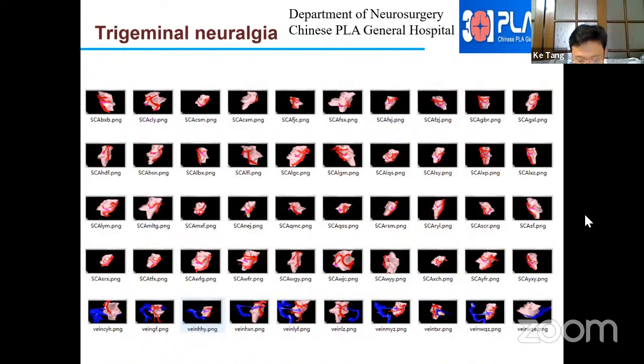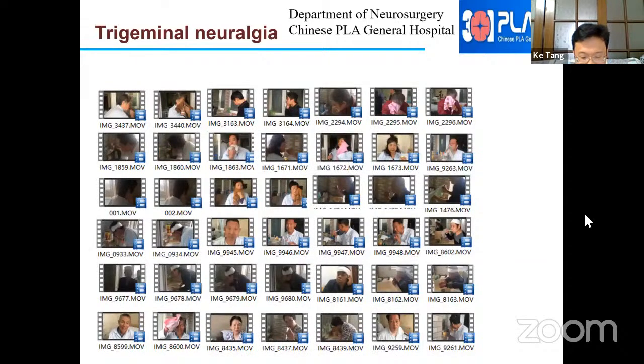With the application of this technique, there was no need to perform additional intraoperative MRI, and the duration of stereotactic head frame immobilization is shortened. In addition, clear display details of the neurovascular complex on high-field strength MRI will help determine the appropriate isocenter position. The precise co-registration of multimodality imaging can be implemented by pixel-to-pixel alignment according to the various anatomic landmarks in the skull base.